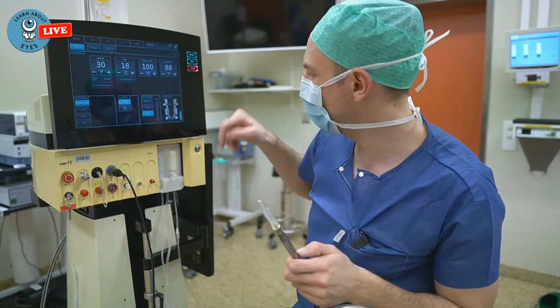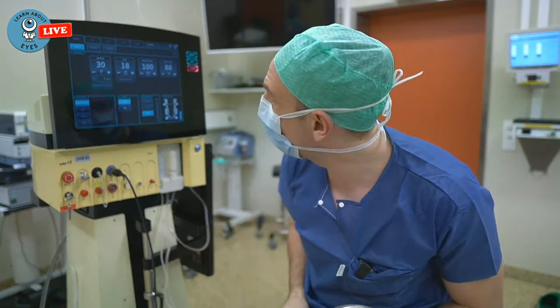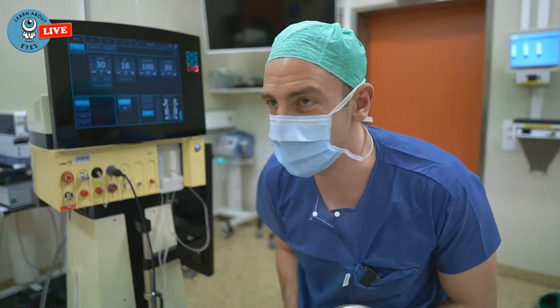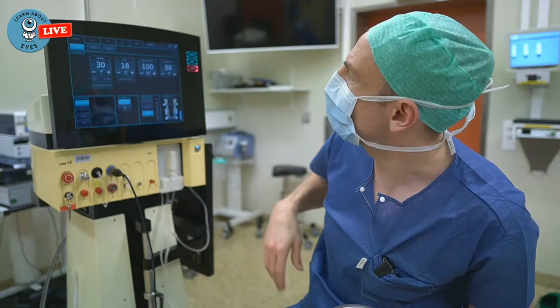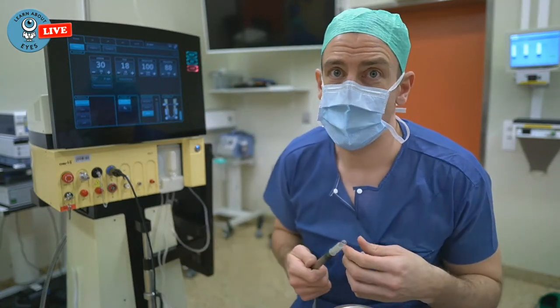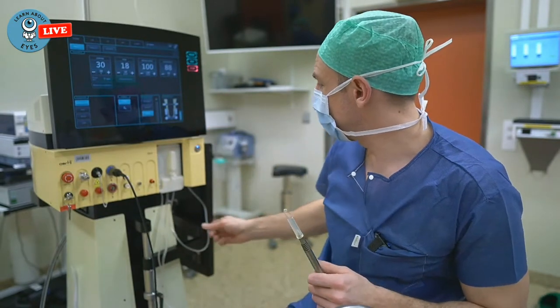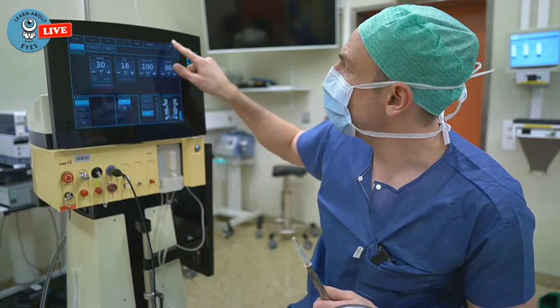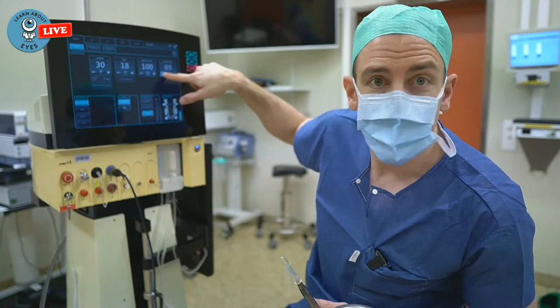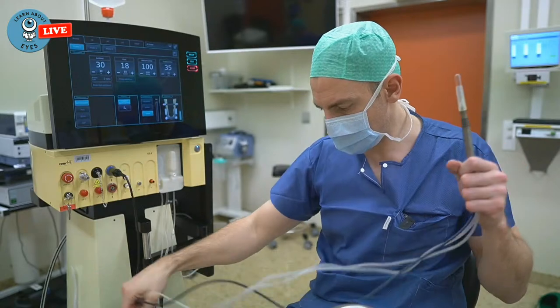Ah, I have to choose Phaco first. See, this is only what you'll learn if you do this yourself at night alone without somebody showing you. I didn't push Phaco, so it didn't go up, and it didn't start. And maybe someday you have somebody new, or you're operating in the middle of the night, somebody doesn't know how it works. It's good if you do. Okay, so this is my program. Now, this bottle height is definitely way too high for these plastic eyes. It's gonna get really messy.